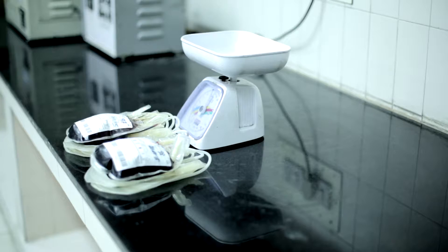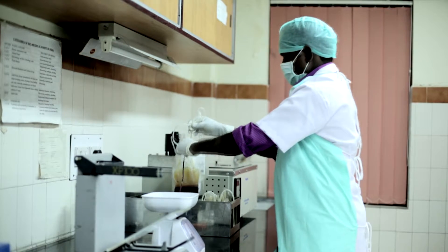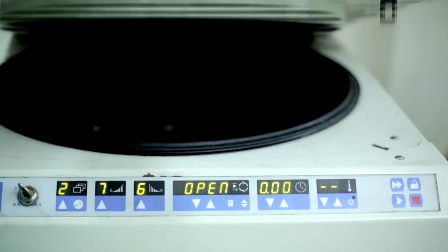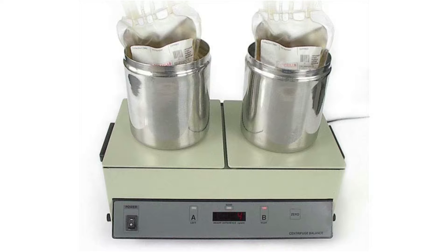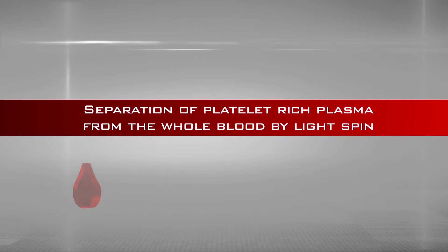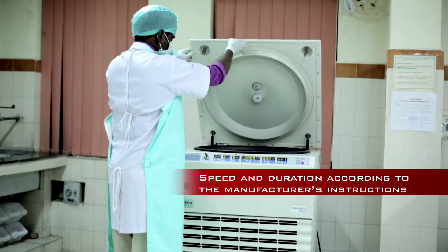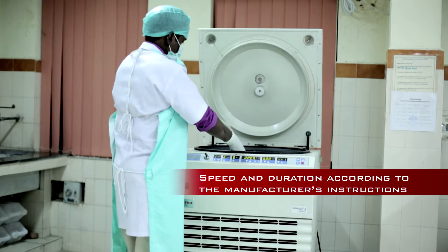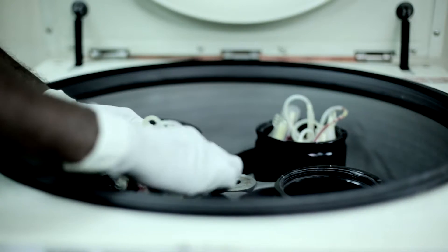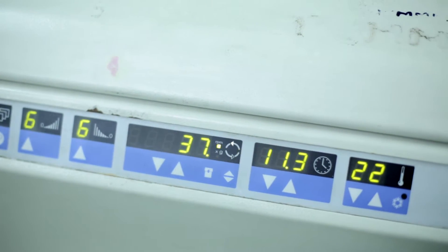If platelets have to be harvested, the blood bag should be kept at room temperature (20 to 24 degrees centigrade) and should be separated within 6 to 8 hours from the time of collection. The refrigerated centrifuge is brought to the desired temperature and kept ready. Blood bags must be weighed and balanced equally in opposing cups. Program the refrigerated centrifuge for light spin with appropriate speed and duration according to the manufacturer's instructions. The bag should be placed so that its broad side faces the outside wall of the cup. Close the lid and start the spin.